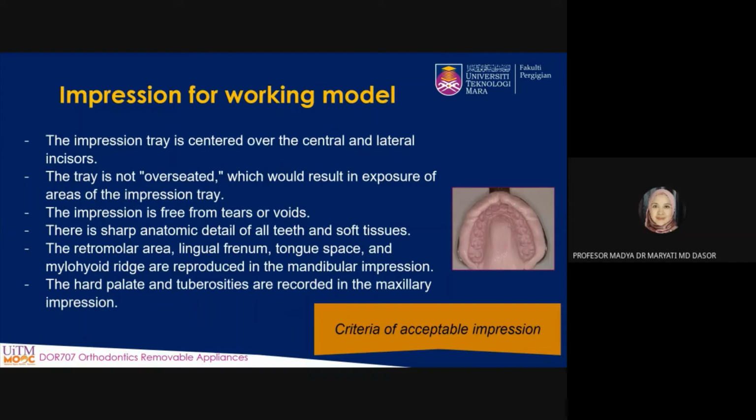The retromolar area, lingual frenum, tongue space, and mylohyoid ridge are reproduced in the mandibular impression, while the hard palate and tuberosities are recorded in the maxillary impression.